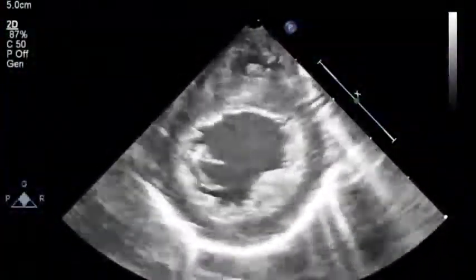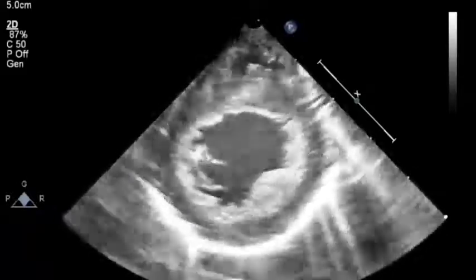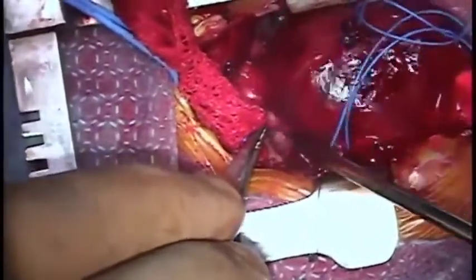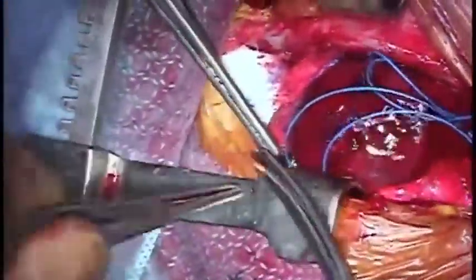This shows good wall motion in all three coronary territories with some mild dyskinesia of the posterior septum and adjacent free wall, probably related to the long clamp time. Heparin is reversed with protamine and hemostasis is secured. Two atrial pacing wires were applied and the chest is splinted open. The patient is then returned to the intensive care unit in a stable condition.